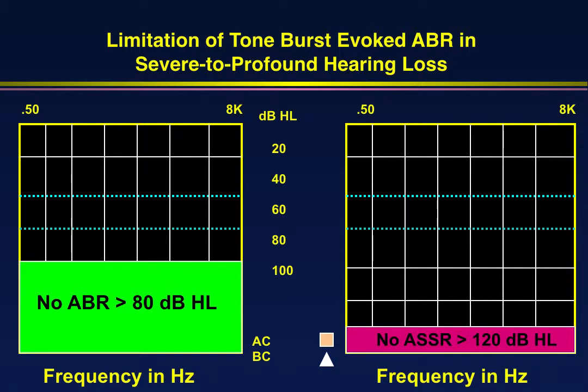And of course, we always give the parents the decision. They always have the ultimate decision on how their child should be managed, but we always present a cochlear implant as an option. And of course, many parents, most parents, certainly hearing parents, will immediately accept that option. We can get to that point within really a day or two after the child's born if we have ASSR proving that there's absolutely no response at all.